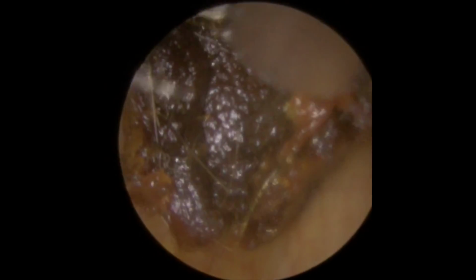So now we've got this softer section. Now we're just moving this forward, maneuvering it out of the ear canal. You can see a nice big lump there. So it's broken away from a much deeper section here. So you can see that the wax on the right side comes a bit further towards the camera. So we're going to take that piece away first, because that's going to anchor some of the rest of this in place.